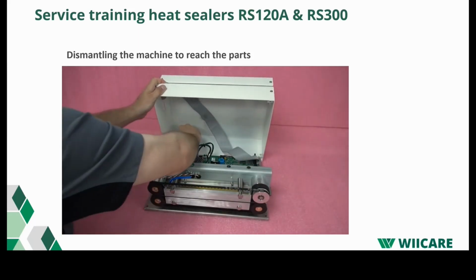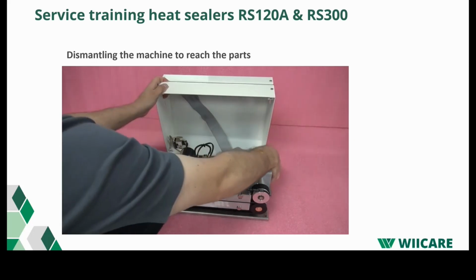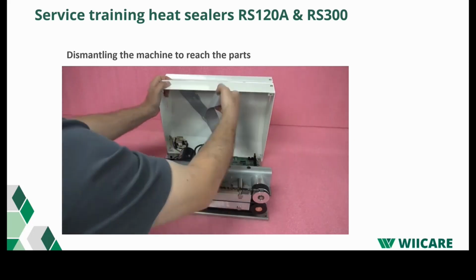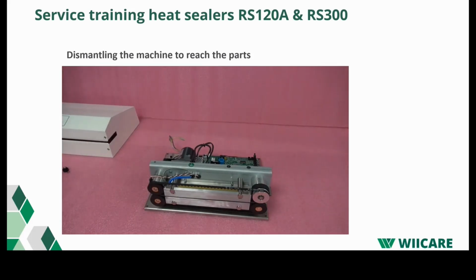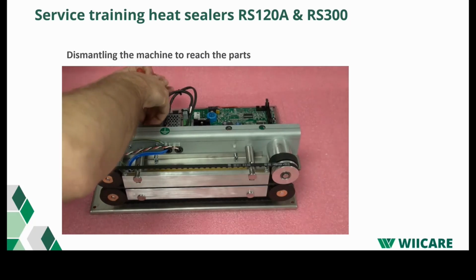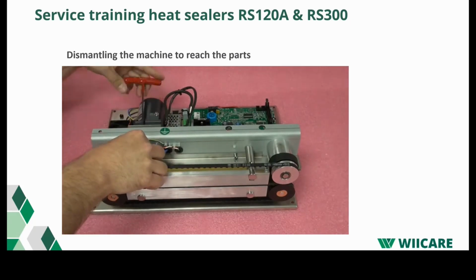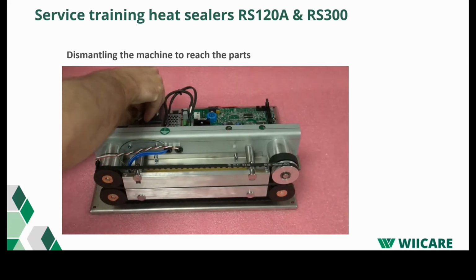Disconnect the wires. Remove the element supports from the top heating element. To release this screw, you go through the bracket of the motor assembly.